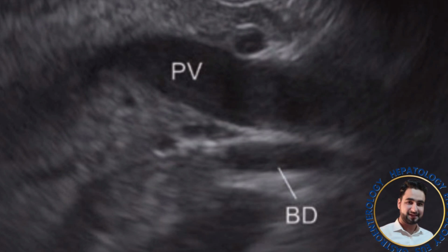And the result of that maneuver is what we call a controlled blind slide. Now, I know the word blind might sound a little scary, but it's totally expected to momentarily lose that perfect image. You have to trust the maneuver. This action is what physically moves your scope from the fundus down to the body, and it's what transitions you from that liver window right into the pancreatic window, where the rest of the duct is waiting for you.